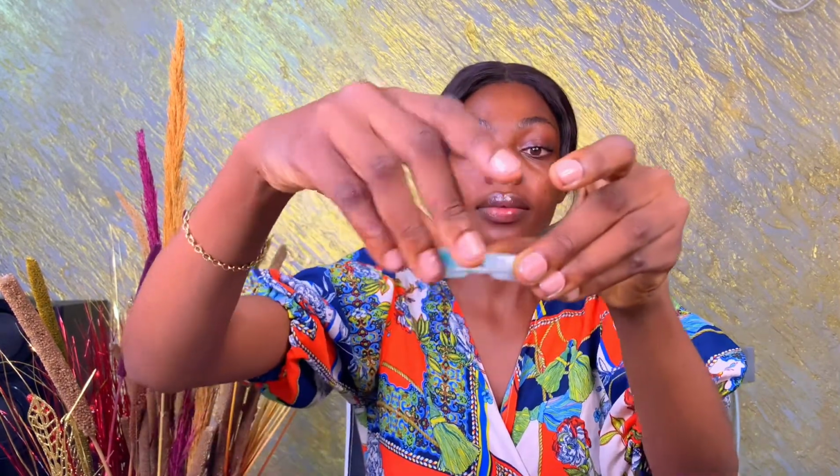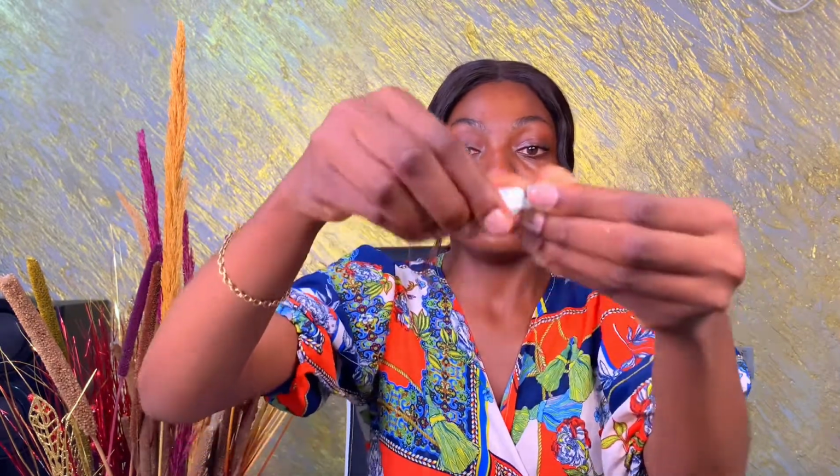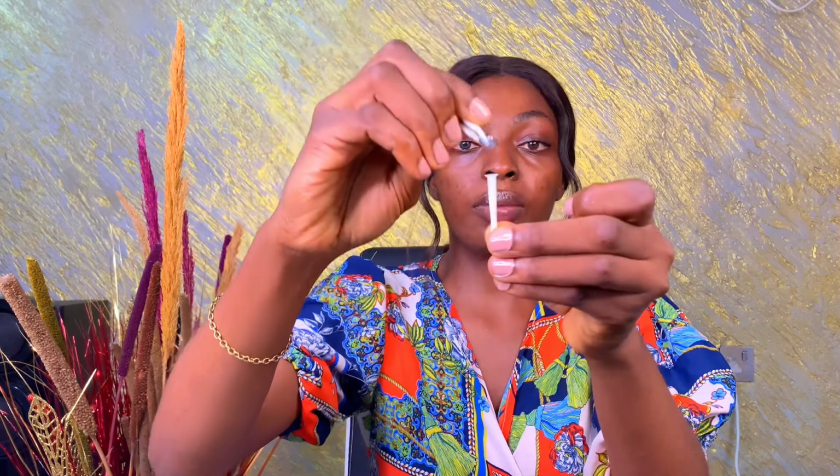Let's cover, open this one, pick it up, place it on the applicator, and then you want to put this in. Okay. There goes the tear, and then you drop in. Alrighty, all right.